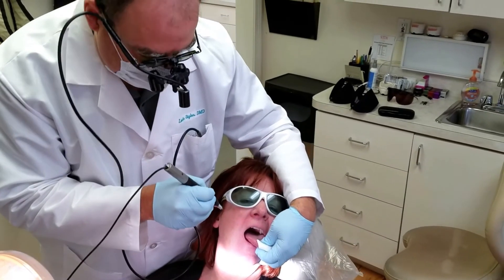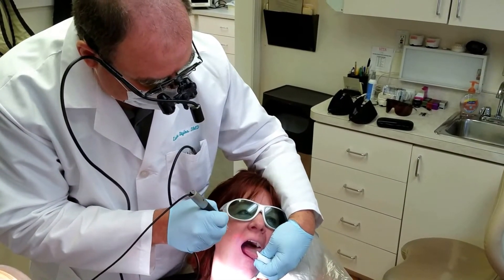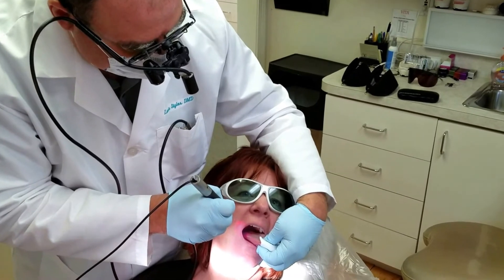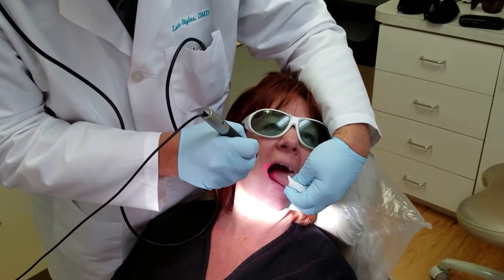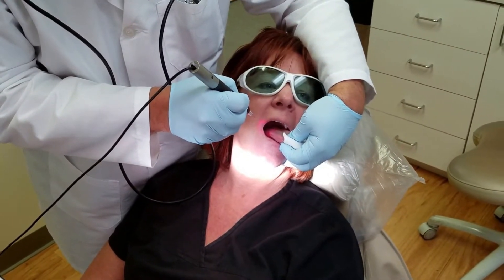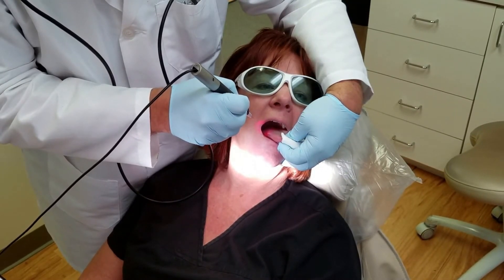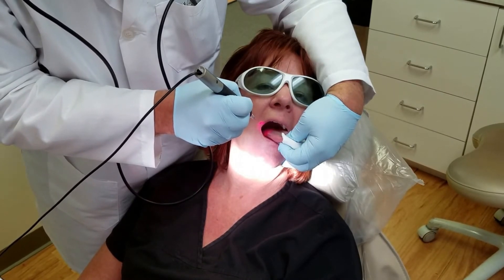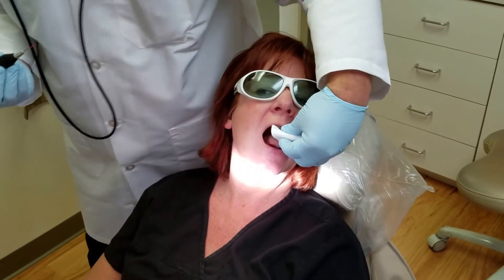She's going to let me know when she feels something. Notice we're not touching anything — there's no novocaine. Now we back off a little bit, then we can go a little closer. How's that feeling? You almost feel immediate release — like it's immediately stopped hurting a little bit. It feels warm when you do it. It doesn't hurt. Like a warm sun.